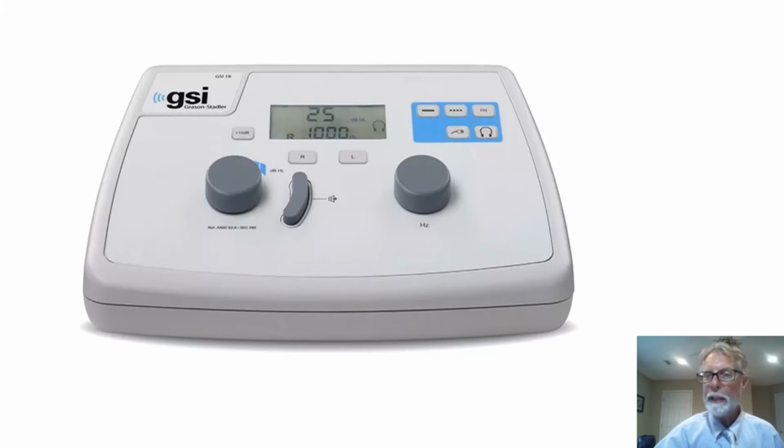Next to that, in the middle of those three, you see a dotted line that just represents a pulsed tone. So now, instead of continuous tone, it is pulsed. Beep, beep, beep, beep, beep at the appropriate rate. That's another option of stimulus.